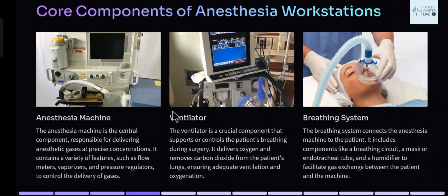Ventilator. Supports or controls the patient's breathing by delivering oxygen and removing carbon dioxide, ensuring proper ventilation. Breathing system. Connects the anesthesia machine to the patient, including components like a breathing circuit, mask or endotracheal tube, and a humidifier to facilitate gas exchange.